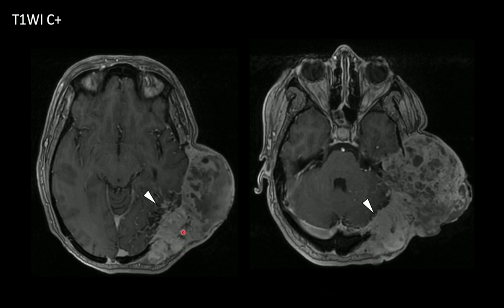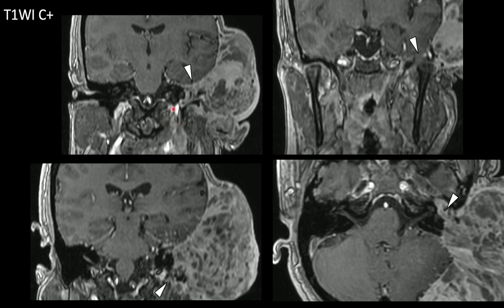The lesion presents angiogenesis characterized by multiple dilated and tortuous vascular structures in the adjacent cerebral and cerebellar parenchyma. There is destruction of the tympanic, the petrous, and mastoid process of the left temporal bone, and also the left temporomandibular joint is involved here. And we couldn't see the geniculate ganglion and the facial nerve in all its segments.